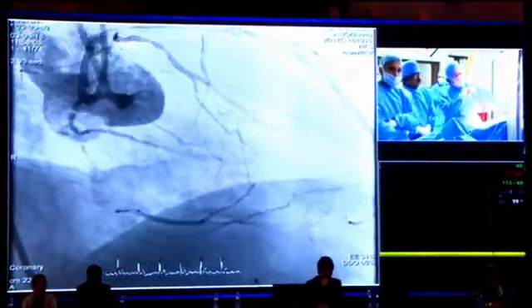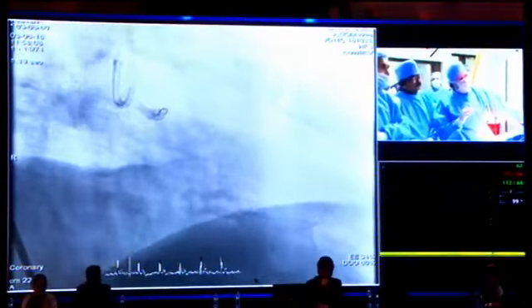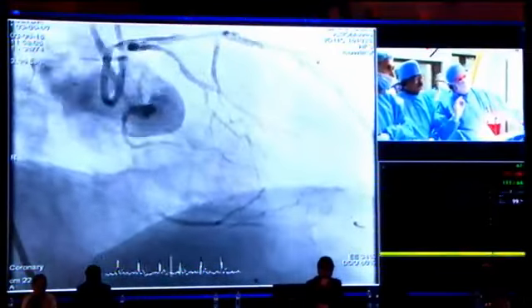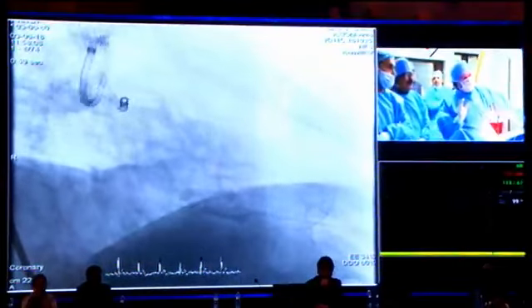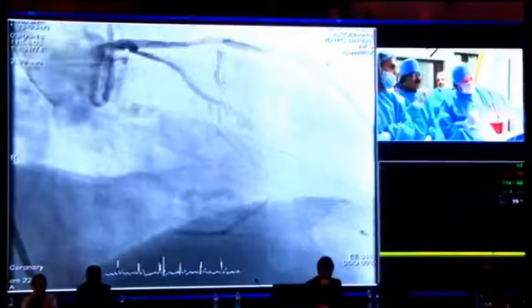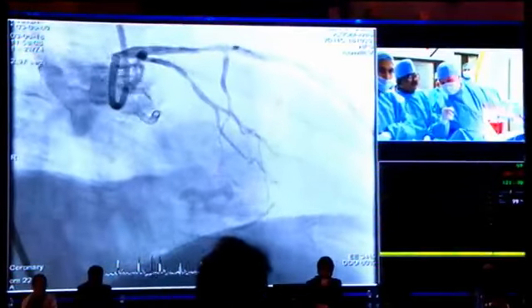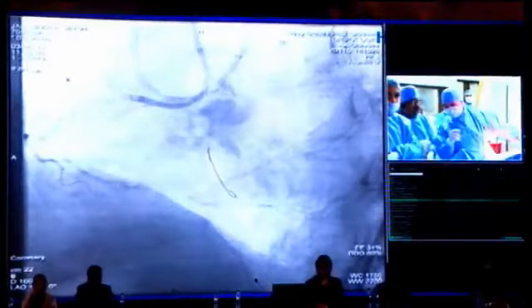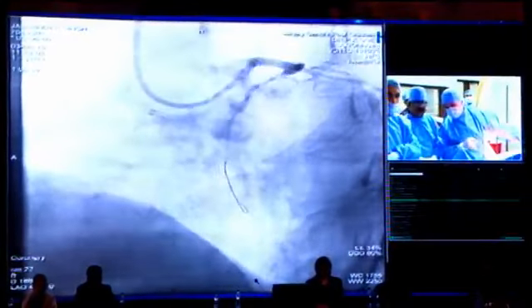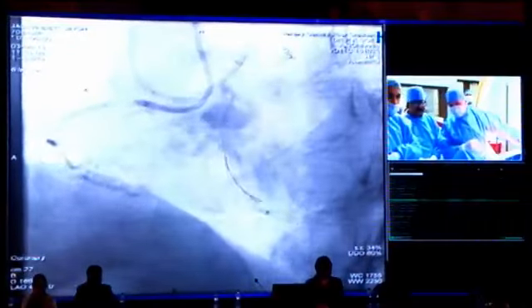I put, as you see on this shot, a wire into the distal LAD, and Dr. Goel tried to leave the stent free, but it never works. So I specifically put the stent slightly beyond the septal, but there is still difficulty getting into the septal. We should see also the second plane, the B plane. So we have the luxury of a biplane. So this is the situation. Maybe you want to make a short comment?